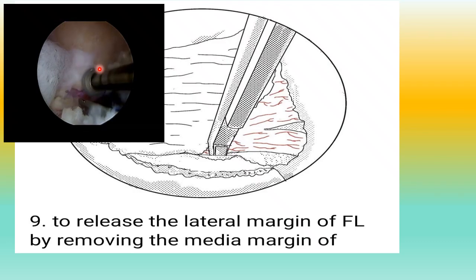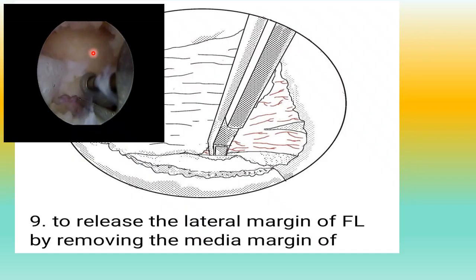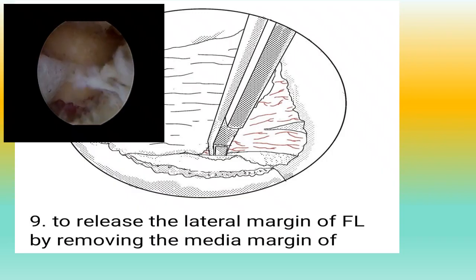This is another case for incision surgery. We remove the SAP, but this white, shiny, cancellous surface of the SAP is a landmark for your orientation also, and where you are.